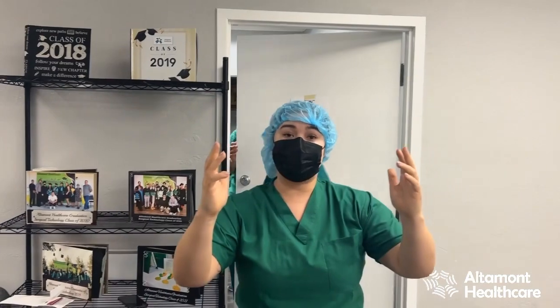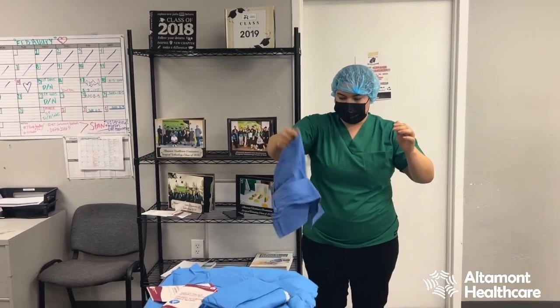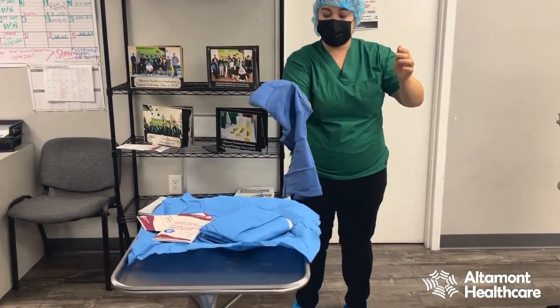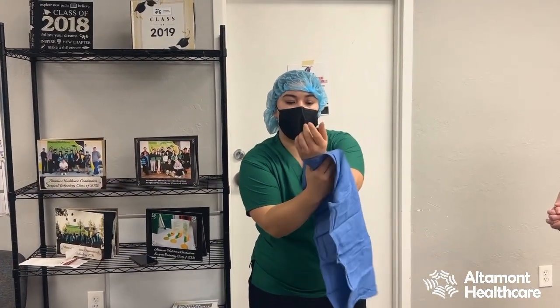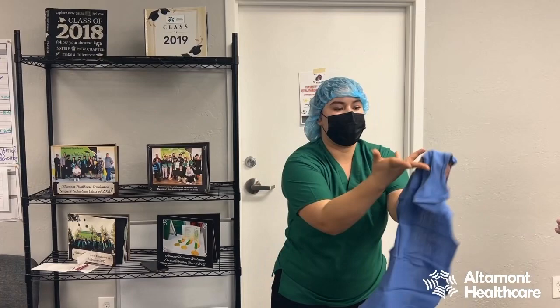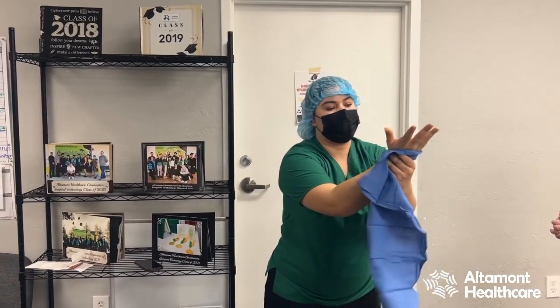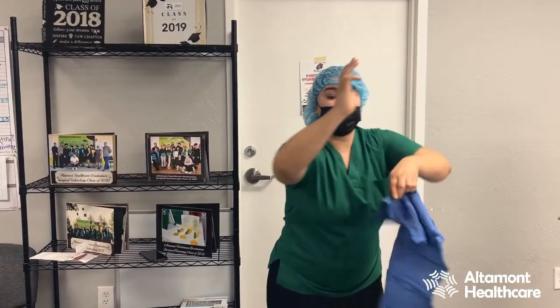I've performed my surgical scrub and now I'm wet. I'm going to avoid getting close to my sterile field. I'm going to grab my towel just by pinching it and dry my hands. I am patting — I don't want to rub at all. We want to avoid any dry skin or any other debris.